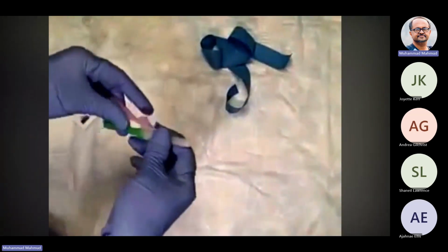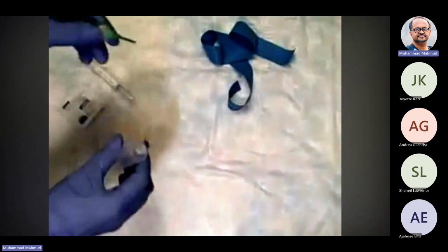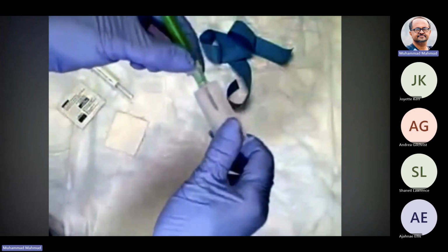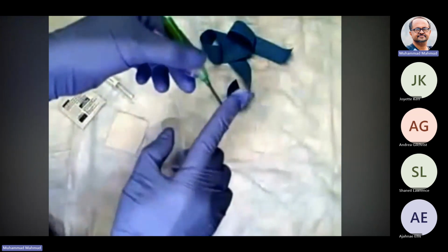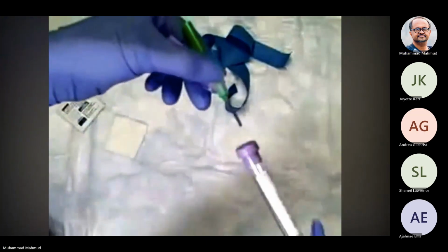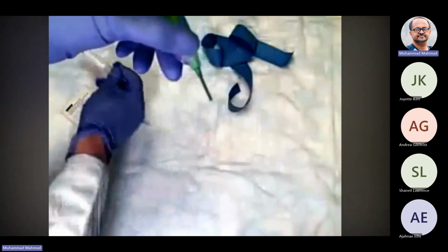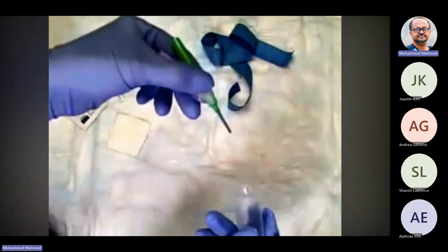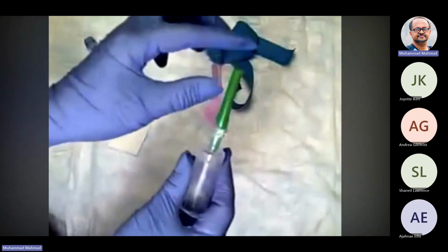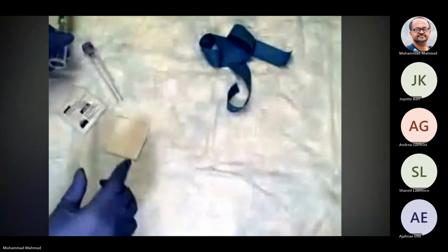I'm actually going to connect the needle to the hub before we begin. You can see this attaches right here. It screws in. And be careful because this is rubber on the outside, but underneath is a sharp needle that actually pokes right into the vacutainer and breaks the seal on this. So be careful because if you push hard enough on this, you can stick yourself. So we're going to attach that, and then our needle is underneath here, so when we're ready to perform the procedure, we'll just remove this.